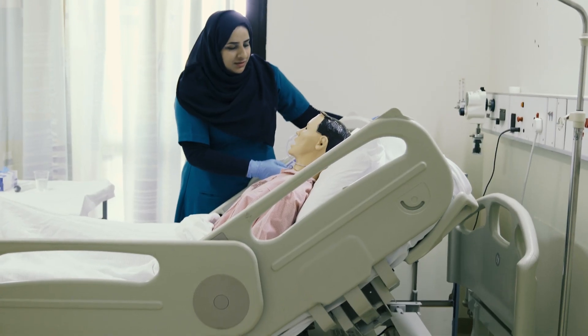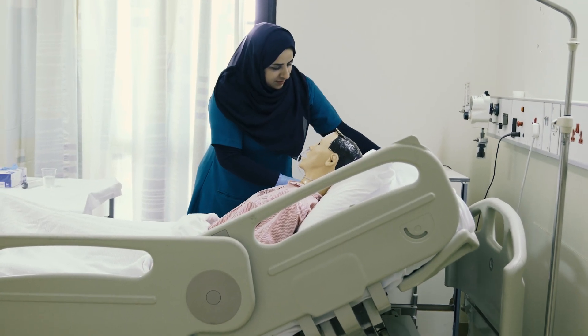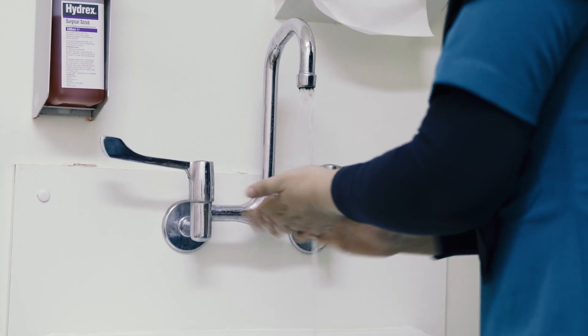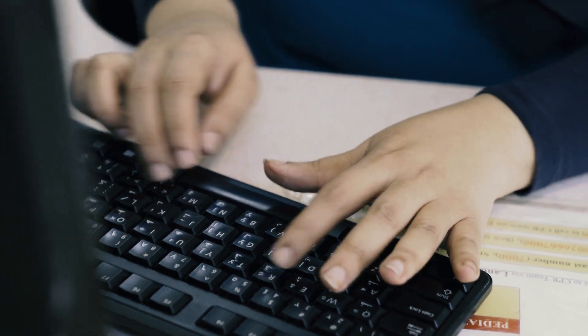Reposition the patient comfortably. Reassure the patient. Discard the materials used. Then wash your hands and document the procedure in the electronic system.